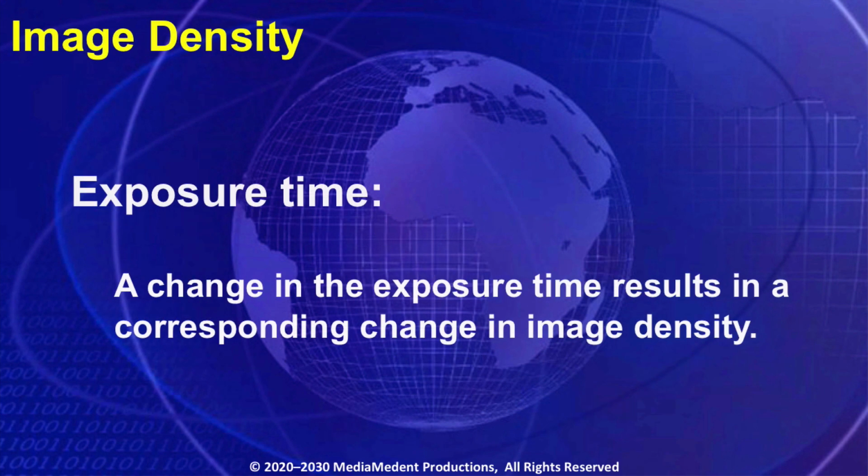Image density may be influenced by the several factors affecting X-ray quantity, or the number of X-rays. However, clinically, the primary factor used to control density is the exposure time.